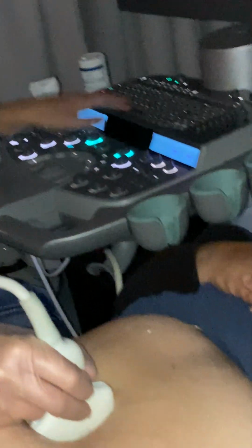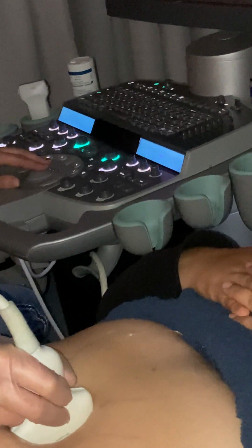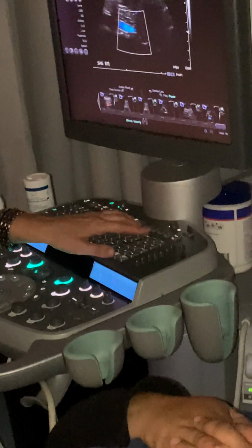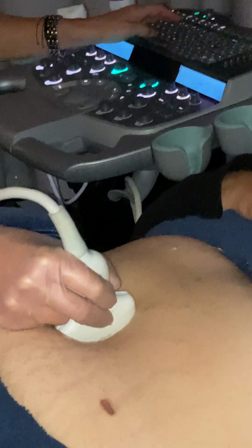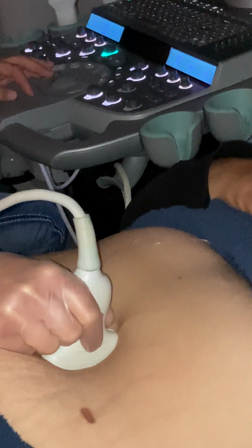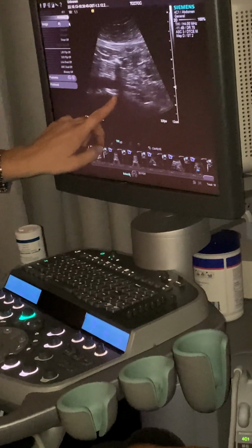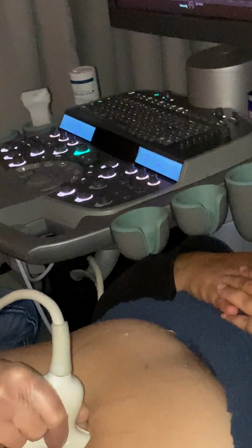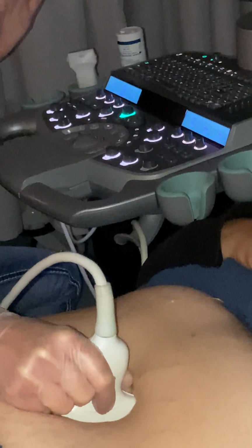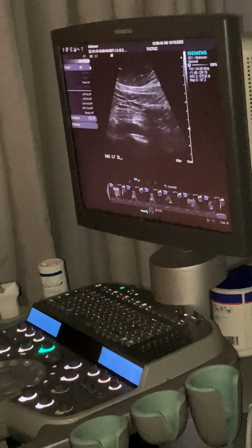Okay, so instead of doing our bilats right now, we're going to do our transverses for the right, and go straight into the sag left. So here's that distal again, so we're at the bifurcation. See how it widens, then it starts to narrow. I was over here a second ago. Let me get that little bowel cloud out of there. I'm going to angle the bottom of my transducer towards that left side and lengthen out that left iliac, which is not as much length as we got on the right.